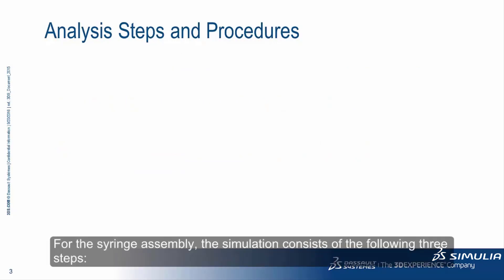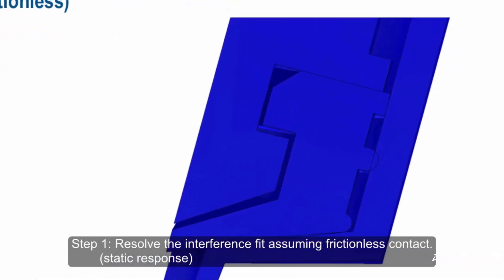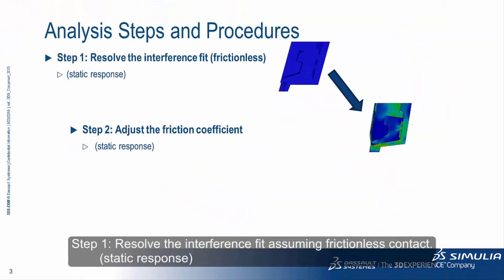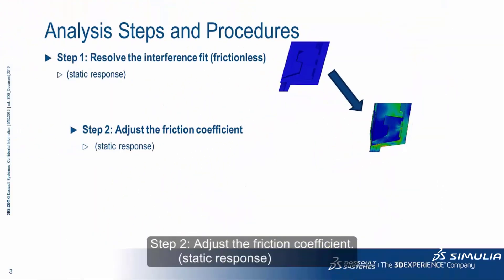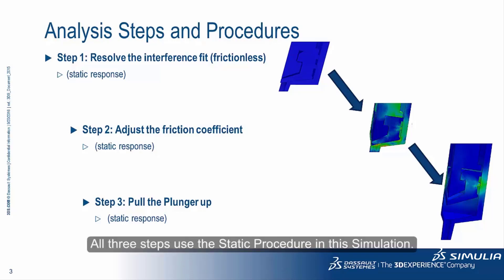For the syringe assembly, the simulation consists of the following three steps. Step 1, resolve the interference fit assuming frictionless contact. Step 2, adjust the friction coefficient. Step 3, pull the plunger up. All three steps use the static procedure in this simulation.